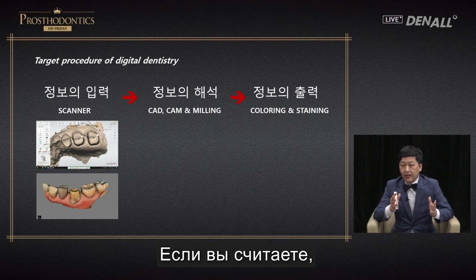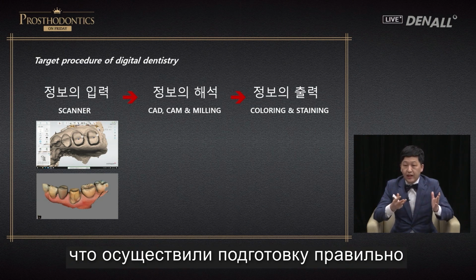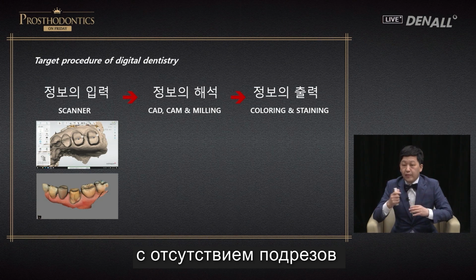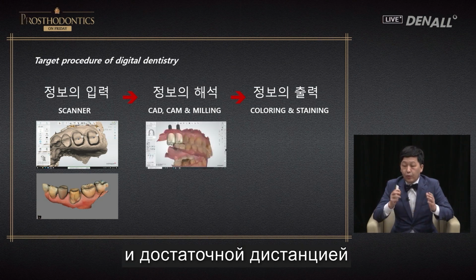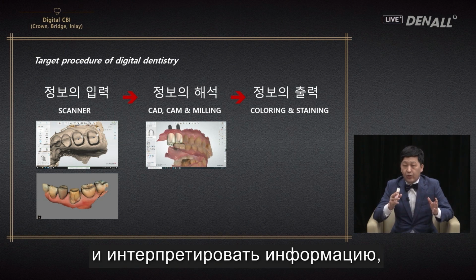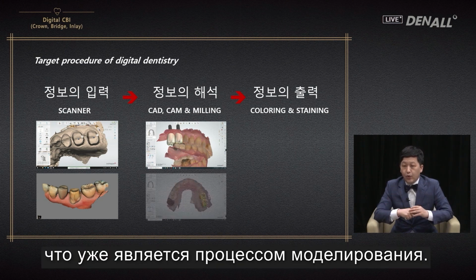If you think you have done the prep correctly and have an accurate margin, no undercut, and sufficient distance with the antagonist, you can do rendering and interpret the information, which is the design process.